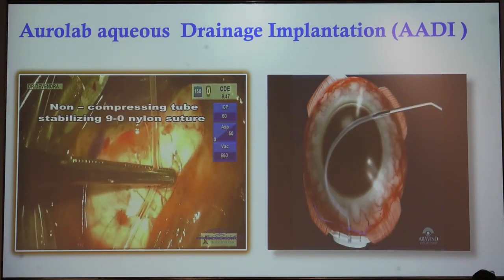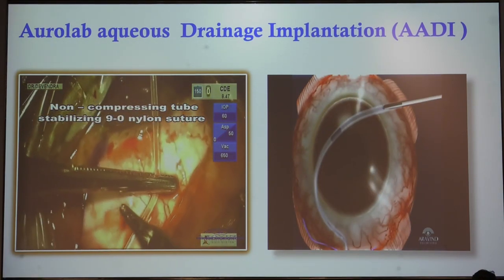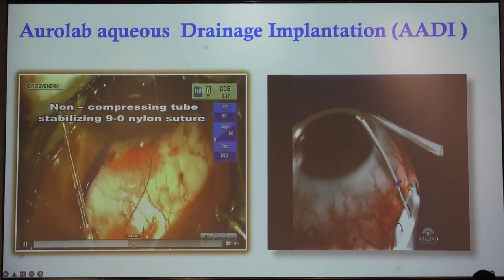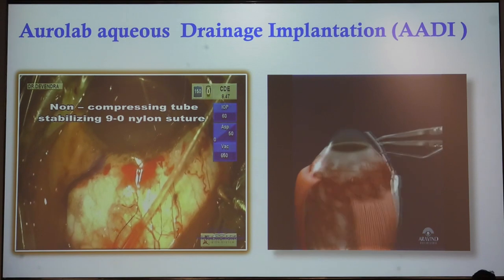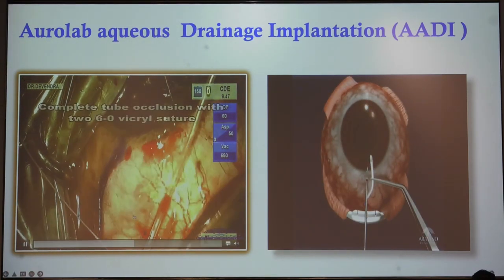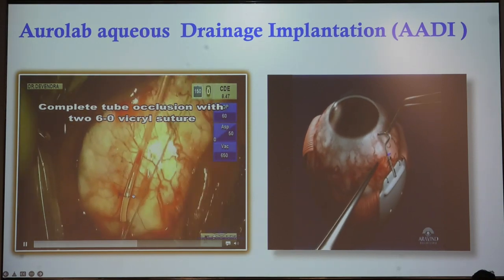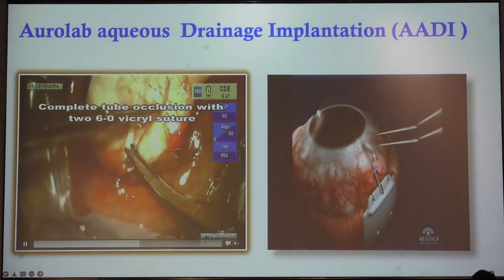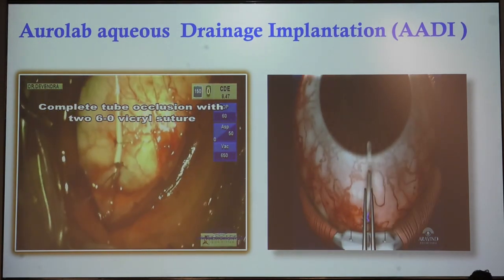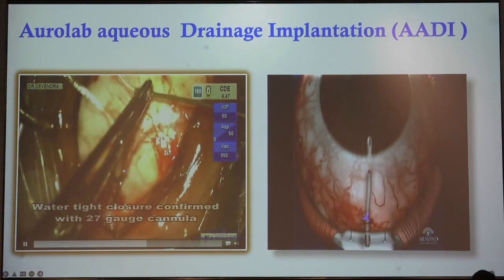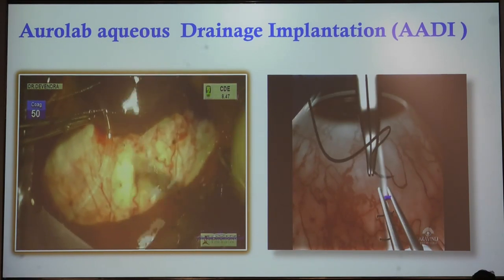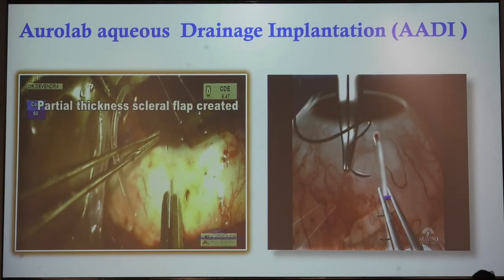The tube has been fixed with a 9-0 nylon box suture — it should not be a compressible suture. After applying this suture, the tube has been occluded using a 6-0 or 7-0 Vicryl suture. Initially we used two Vicryl sutures, but now I use only a single Vicryl suture. The tube is then checked to confirm it is properly blocked.